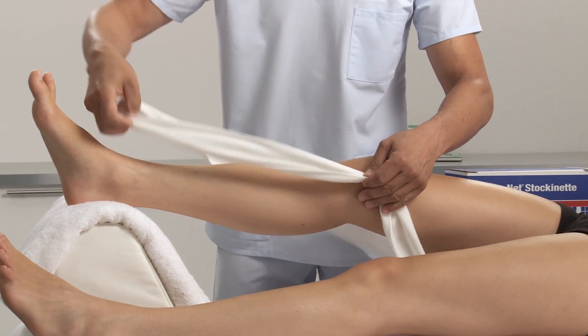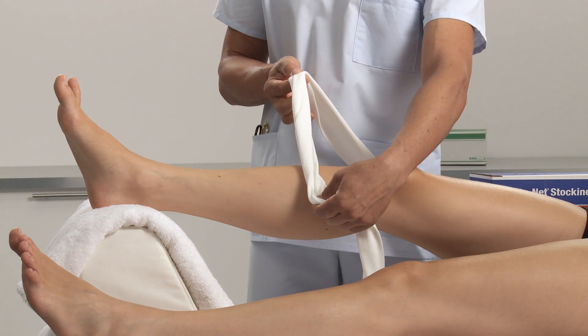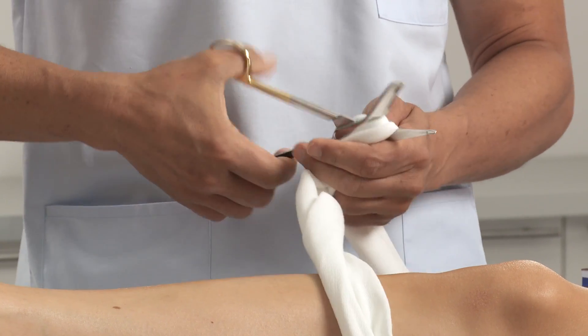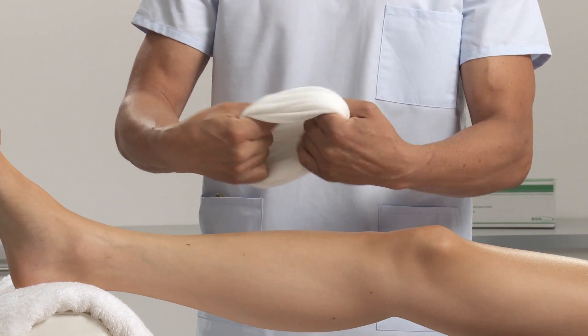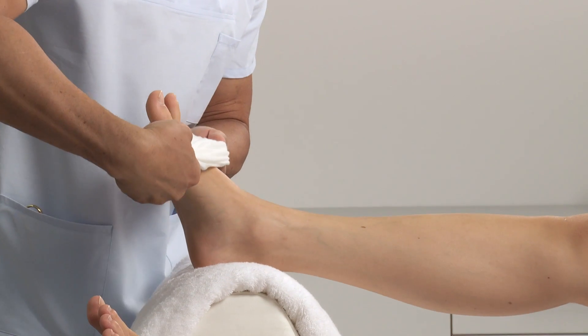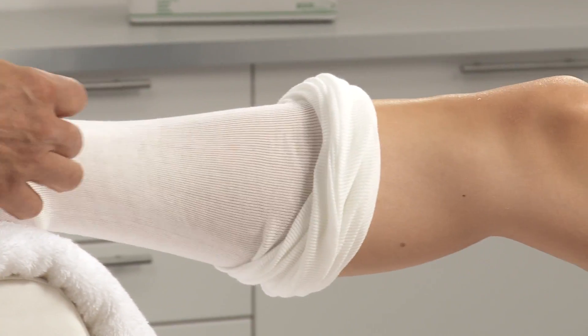Choose the appropriate width of stockinette. Measure the length from the top of the thigh down to the ankle, add another 20 cm or 8 inches, double that length and cut. Roll up the stockinette before applying onto the limb to overcome sliding pressure. Roll off over the leg and remove all wrinkles and creases.